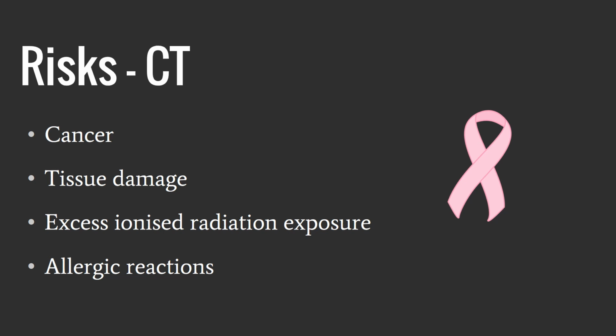There are, however, chances of excess ionized radiation exposure, so it is strongly recommended to not be used on pregnant women or with patients with abnormal kidneys. The contrast medium used in CT scans can also cause allergic reactions.